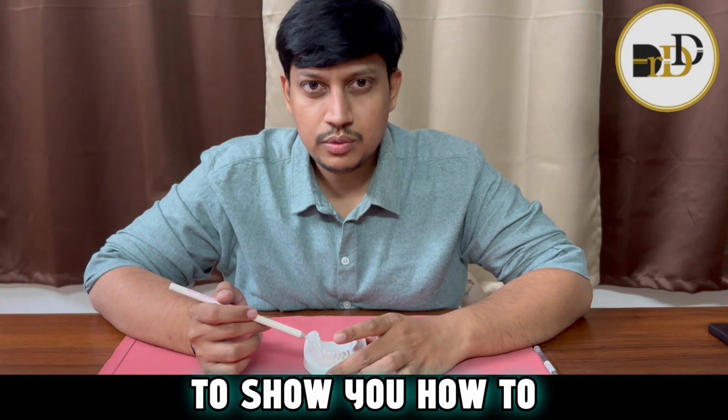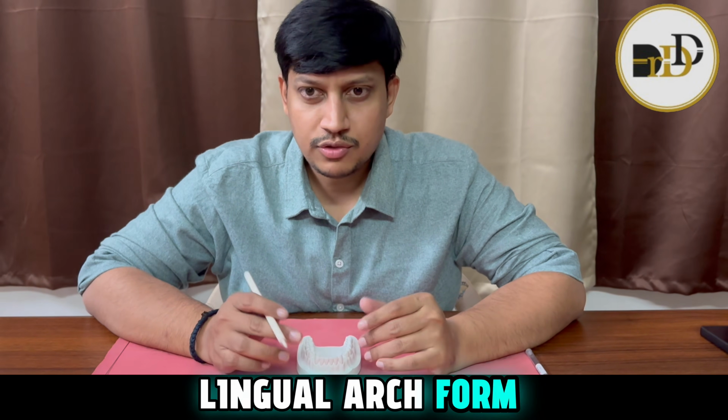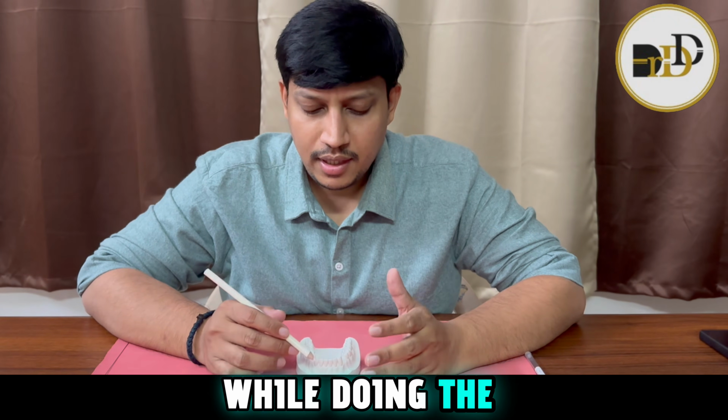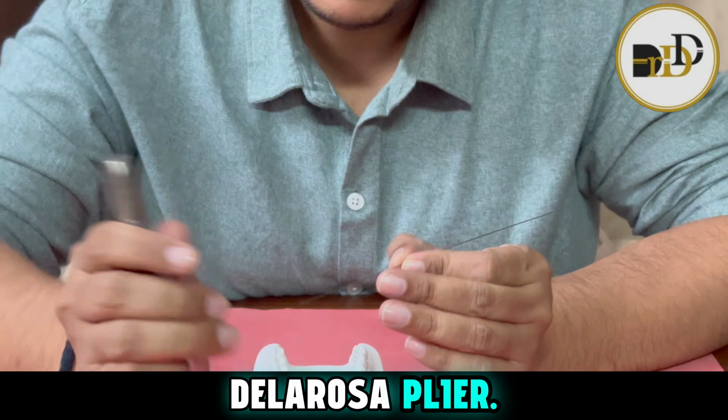Hello everyone. Today I'm going to show you how to fabricate a lingual arch form with the compensation bends while doing extraction space closure. For that we are taking 16x22 TMA wire. For fabricating the lingual arch form I'm using the De La Rosa plier.